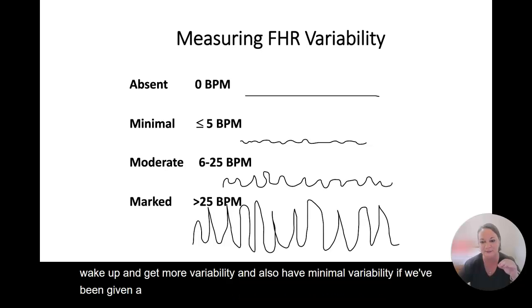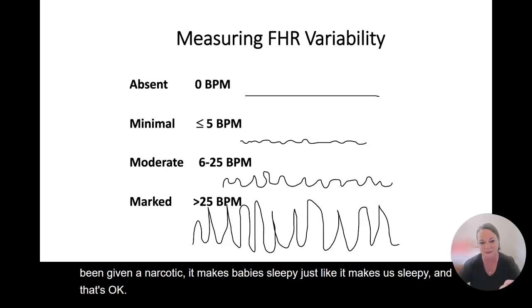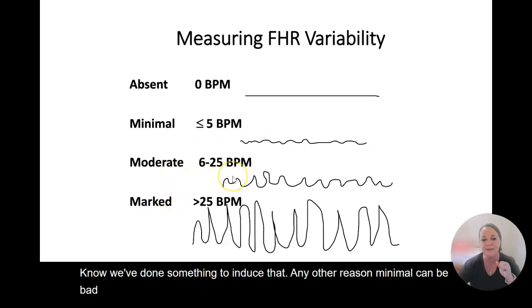It makes baby sleepy just like it makes us sleepy. And that's okay too. We know we've done something to induce that. Any other reason, minimal can be bad. Okay. Moderate is what we want.